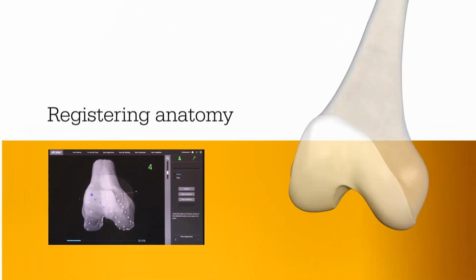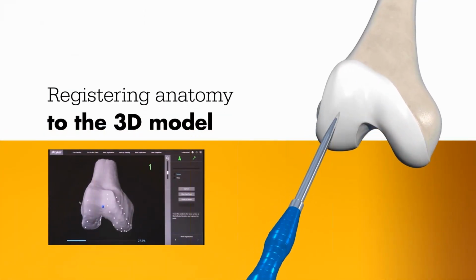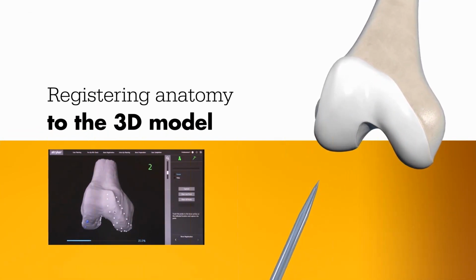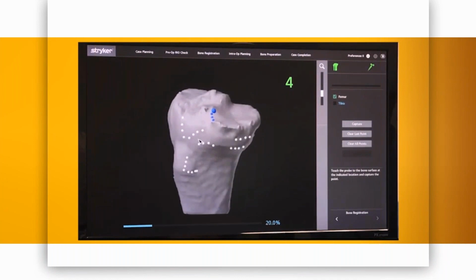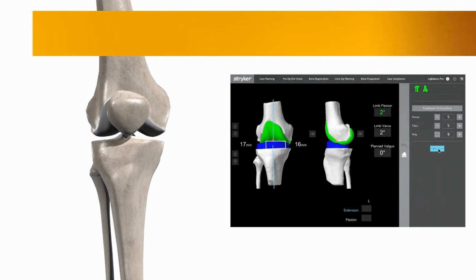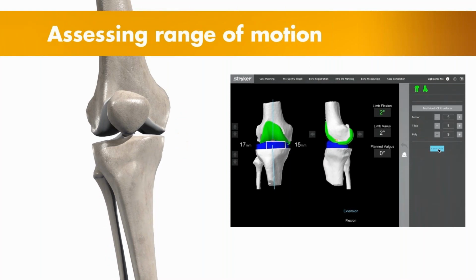During surgery, the surgeon locates points on the knee in order to register the anatomy in the Mako system. This process establishes the relationship between the patient's actual anatomy in the operating room and the 3D model that was used during the planning process. This step helps ensure the procedure is executed to plan. Once the anatomy is registered to the 3D model, the surgeon has the flexibility to modify the preoperative plan based on their assessment of the patient's anatomy and range of motion.